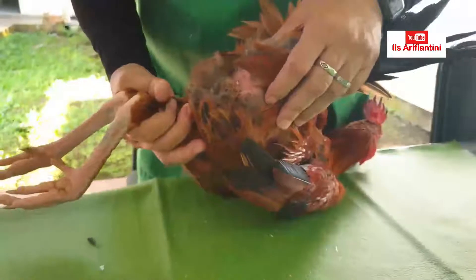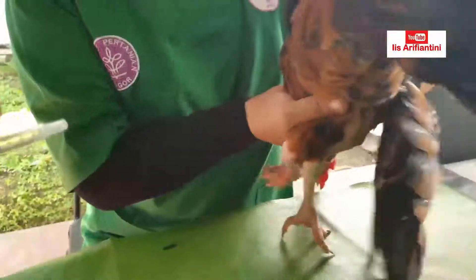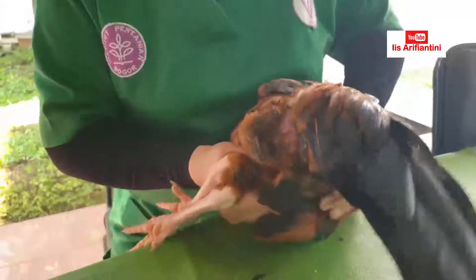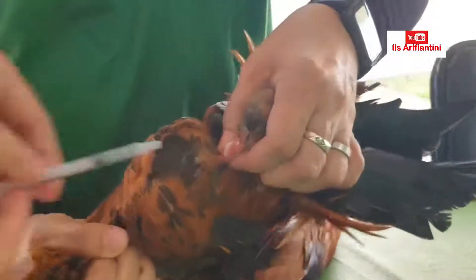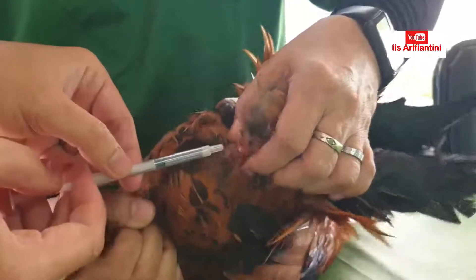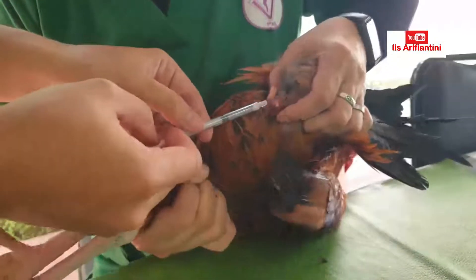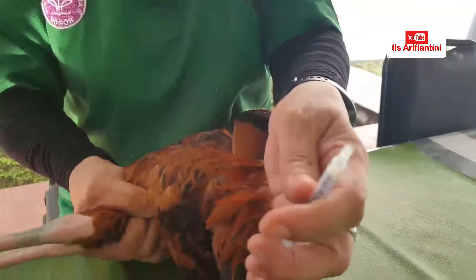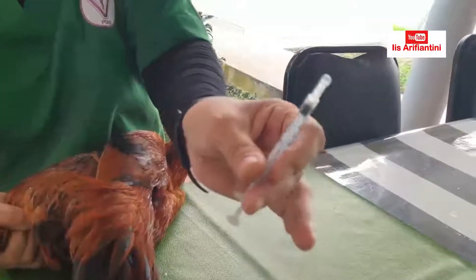Kemudian tabungnya kita pakai pipet atau jarum suntik. Caranya adalah sebagai berikut: ayamnya kita massage dari arah leher ke ekor. Ini baru pertama kali tampung ayamnya, jadi ayam baru pertama kali ditampung. Tapi ini adalah semennya — dapatnya kira-kira 0,1 mili. Semennya kita dapatnya hanya 0,1 mili, tapi warnanya kelihatan.